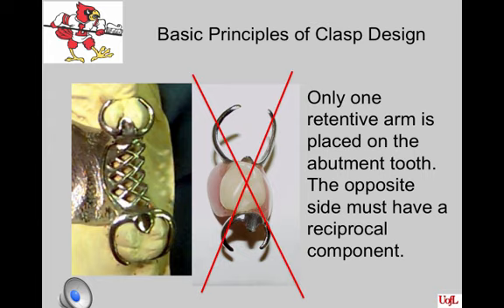If it is done, the retention must be placed on both sides of the tooth to prevent dislodgement. You only do these if you wish to take a high risk of being sued for a patient developing peritonitis because of swallowing the prosthesis and the prongs perforate the intestines, causing massive infection. If you want to sleep well at night, you do not use or do the unilateral partial denture.